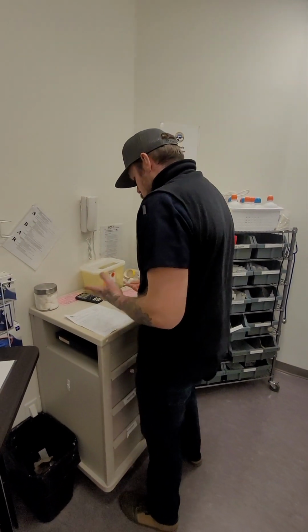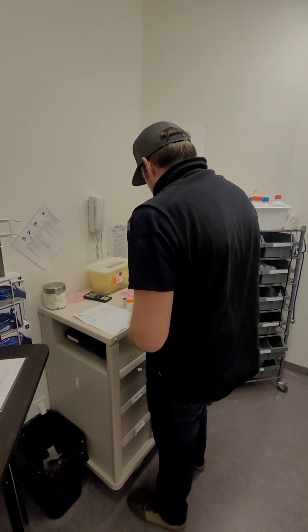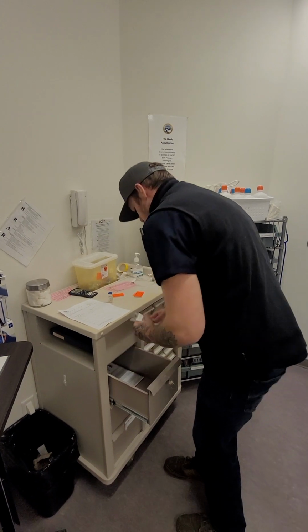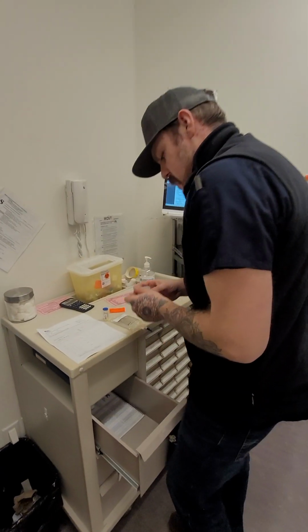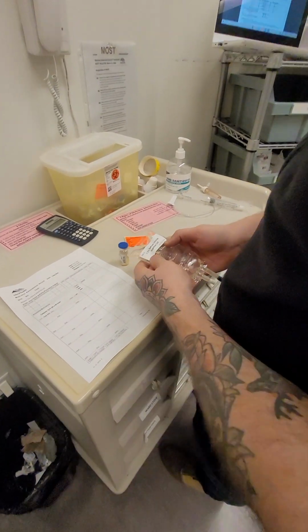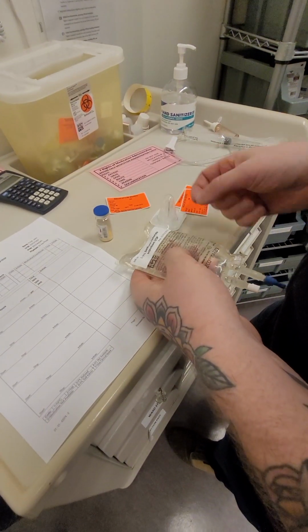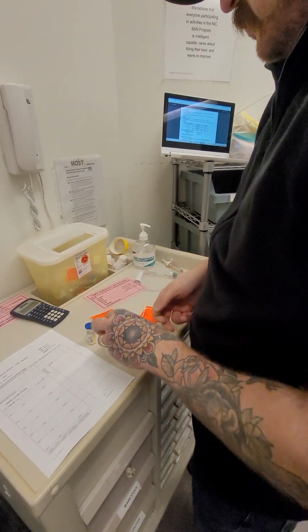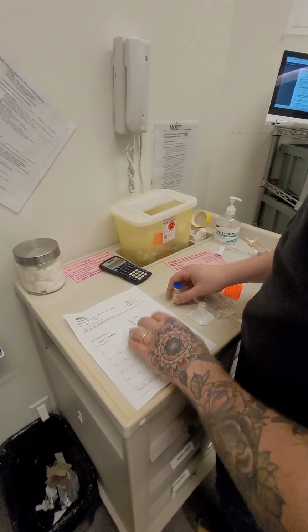Okay, so now that I've done that, I can go ahead and get some equipment ready that I'm going to need to reconstitute. So we've got our saline bag here and our reconstitution device. So this is 0.9% sodium chloride. This is also not expired, so that's good that we're going to be using that. And then this is not expired here, the reconstitution device. Perfect. So we're ready to pour the medication.